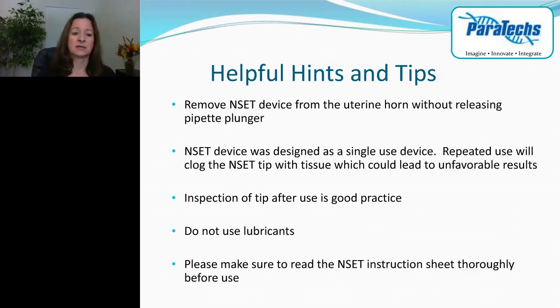As always, inspection of the tip is good practice, just to make sure that the tip is not bent when inserted into the mouse, and also that any material hasn't clogged the tip. Please do not use lubricants during this procedure. They can clog the tip as well, and they are unneeded for insertion of the specula. And please make sure to read the NSET instruction sheet thoroughly before use.